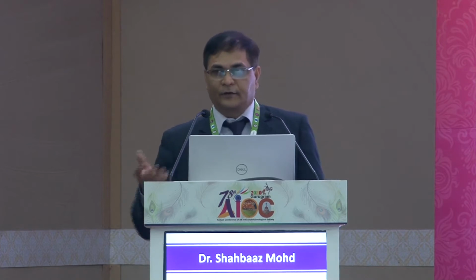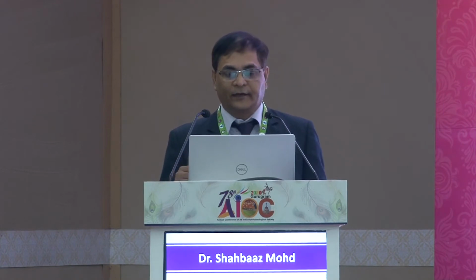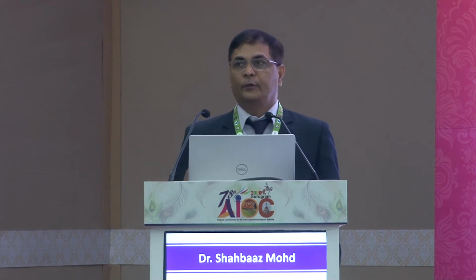This is very important because a small error in axial length gives very large problems in IOL power. One millimeter difference will cause 2.5 diopter change in IOL power in a normal patient. But in a high myopic or very large eye, it will reduce to 1.75. And in a very hypermetropic eye or very small eye, it will be even bigger, that is 3.75. So greater care must be taken for measurement of a shorter eye, and always try to measure both eyes.